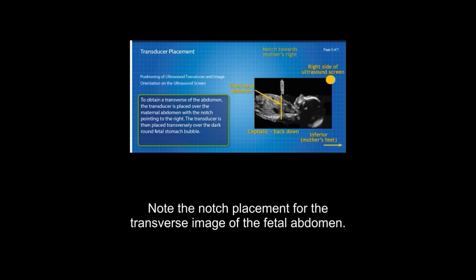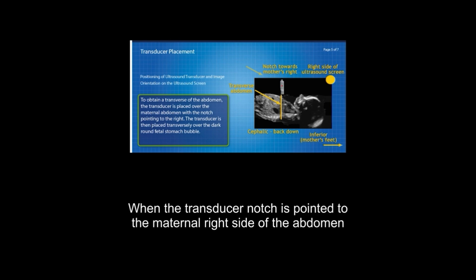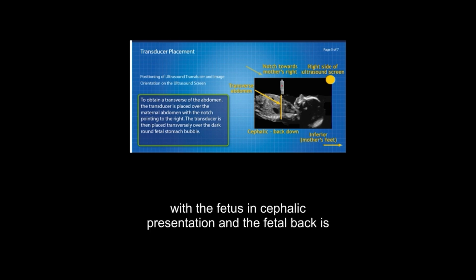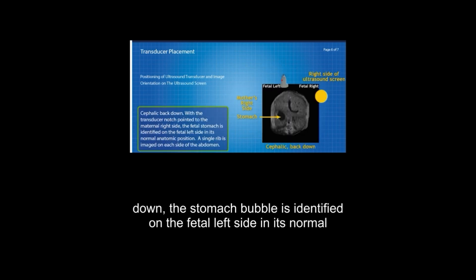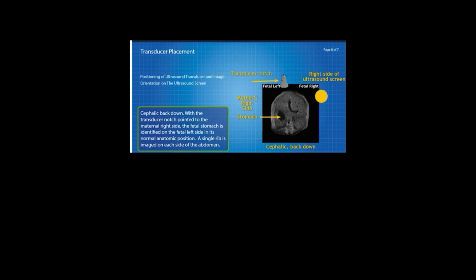In this clip, note the notch placement for the transverse image of the fetal abdomen. When the transducer notch is pointed to the maternal right side of the abdomen with the fetus in cephalic presentation and the fetal back is down, the stomach bubble is identified on the fetal left side in its normal anatomic position.